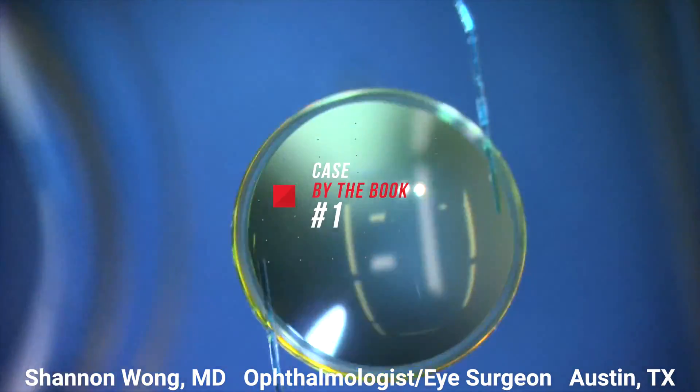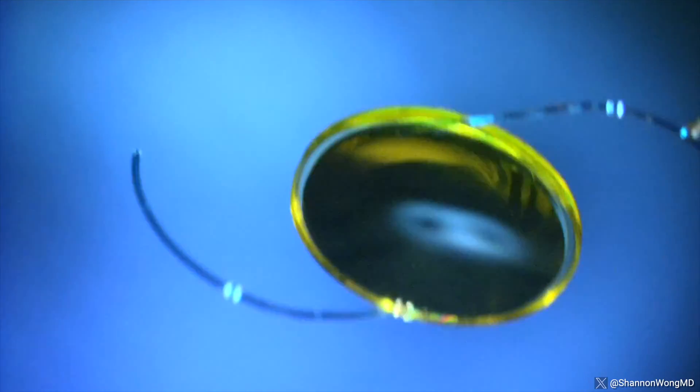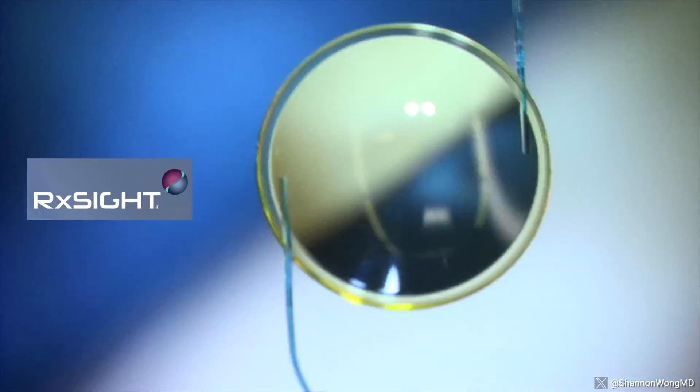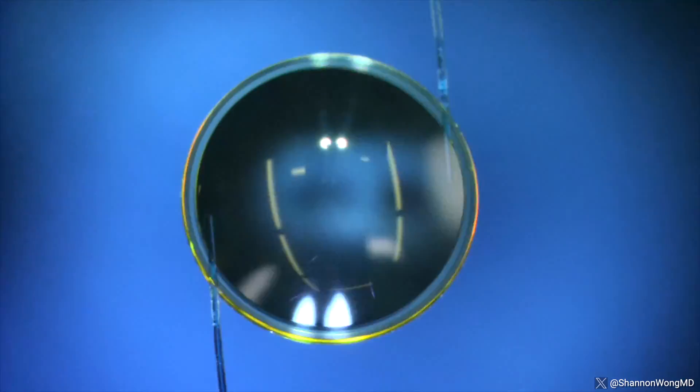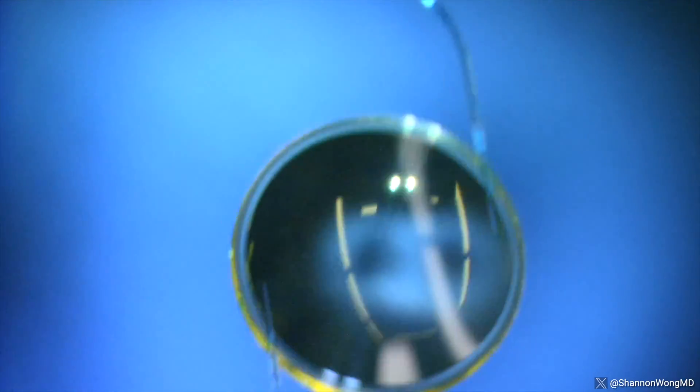Case number one: by the book. This is our first LAL insertion. The LAL is made and distributed by a company called RxSight. This video demonstrates the recommended official by-the-book method that they recommend in 10 steps.